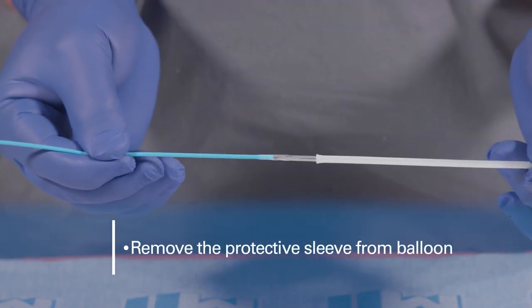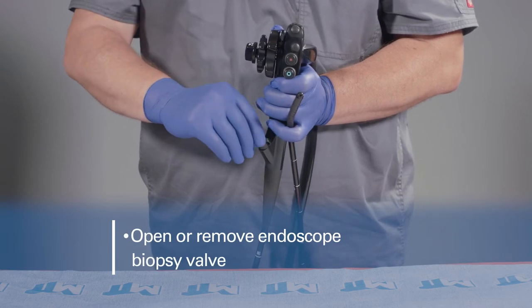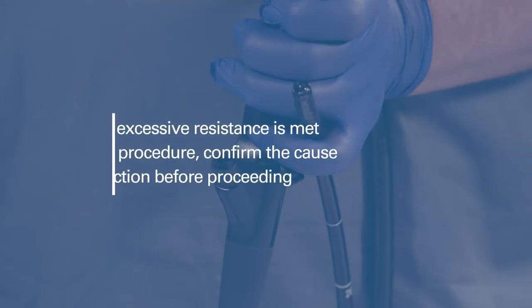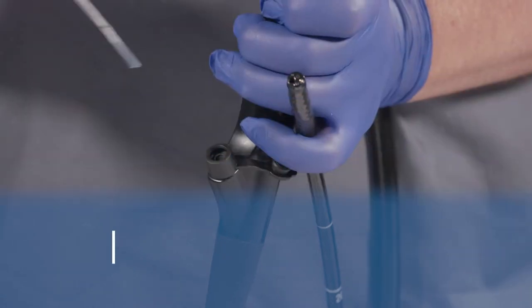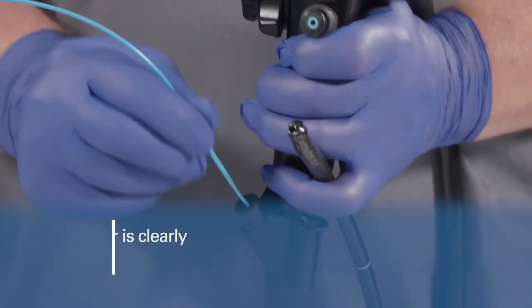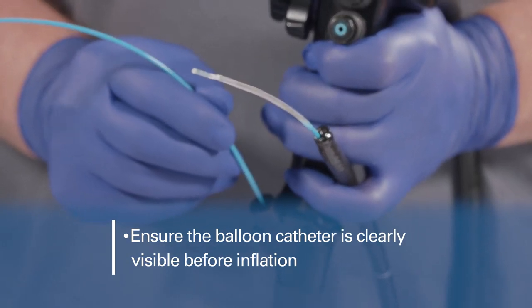Remove the protective sleeve from the balloon. Opening or removal of the endoscope's biopsy valve may help facilitate easier passage of balloons larger than 12 millimeters. If excessive resistance is met during the procedure, confirm the cause of resistance and take remedial action before proceeding. Slowly advance the balloon catheter into the endoscope using short, deliberate movements. Ensure the balloon catheter is clearly visible in the endoscopic view before inflating the balloon.